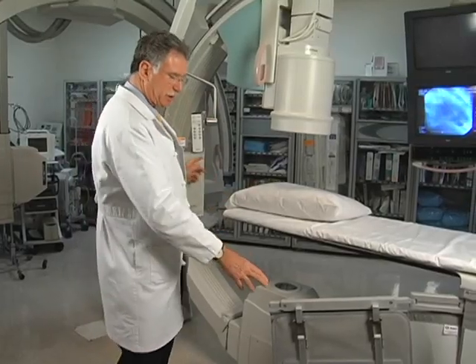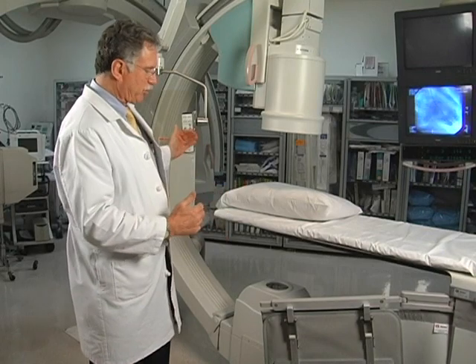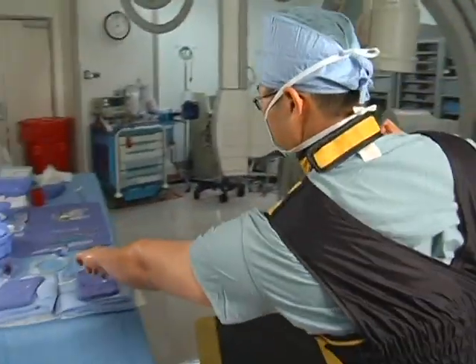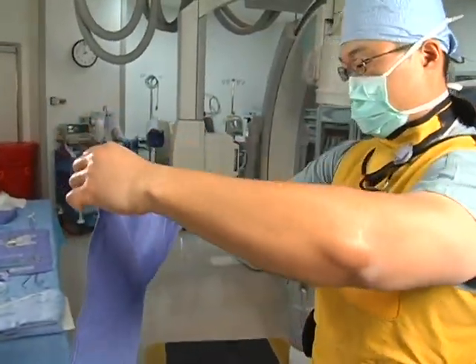Now, beside the shielding that's present for the table and the room, the operators themselves wear lead aprons and a lead thyroid shield. Some individuals wear lead glasses.